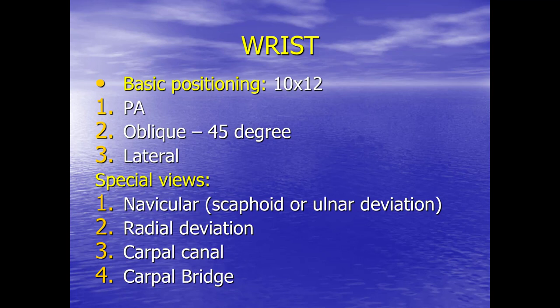So for lab this week, we're going to concentrate on the PA, the oblique, the lateral, and the scaphoid or ulnar deviation views. So there will be 4 views you'll be responsible for lab.